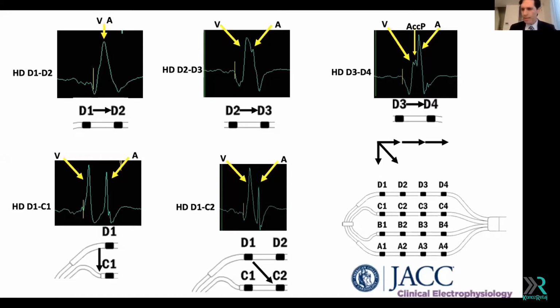So as you can see, in complex supraventricular arrhythmias, the high-density grid has an added value, mostly because you can shorten the procedure time and identify the place of ablation very fast, doing many more procedures during your EP lab day.